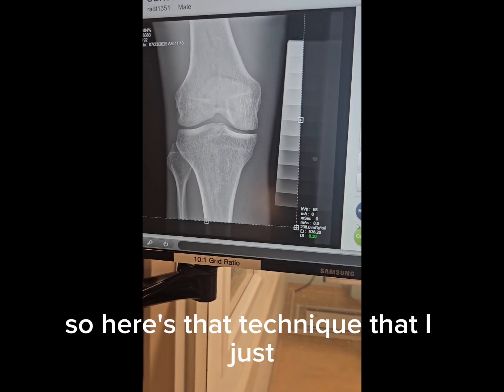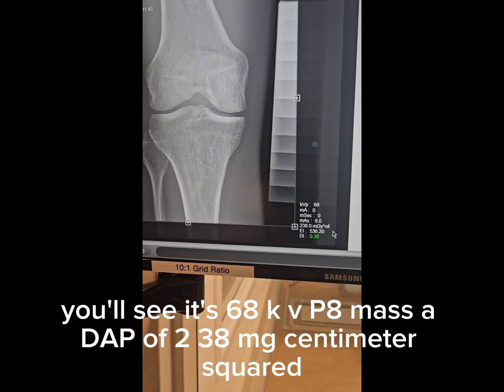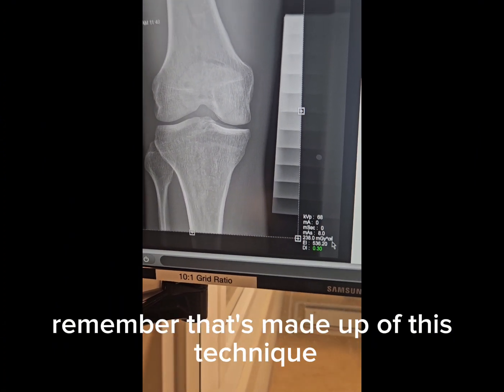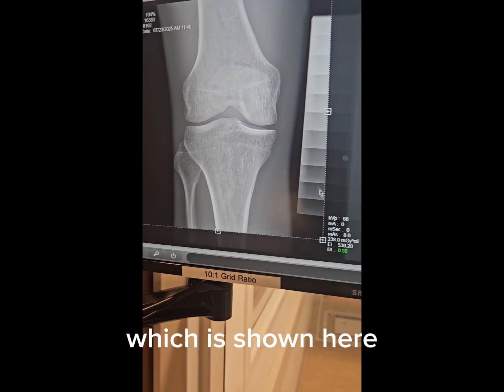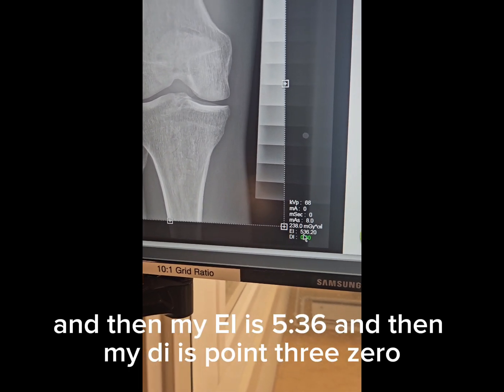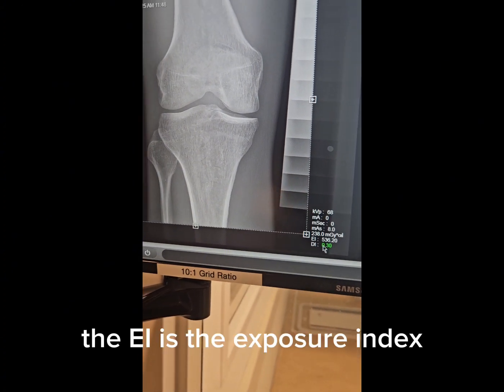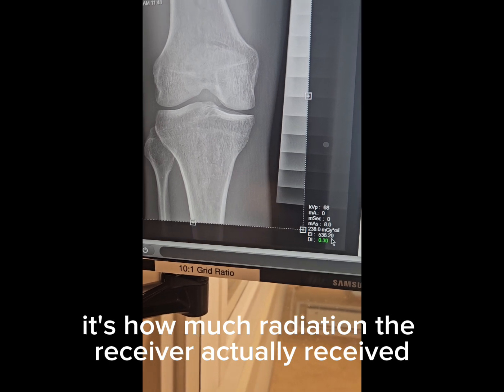Okay, so here's that technique that I just took. You'll see it's 68 kVp, 8 mAs, a DAP of 238 milligray centimeter squared. Remember, that's made up of this technique, but also the size of my collimation, which is shown here. And then my EI is 536, and then my DI is 0.30. The EI is the exposure index. It's how much radiation the receiver actually received.